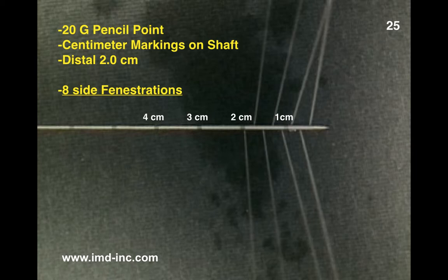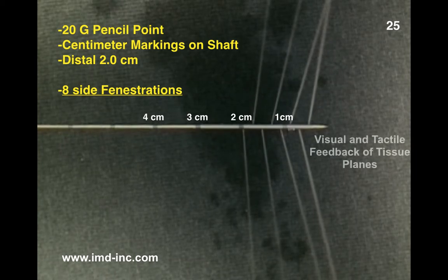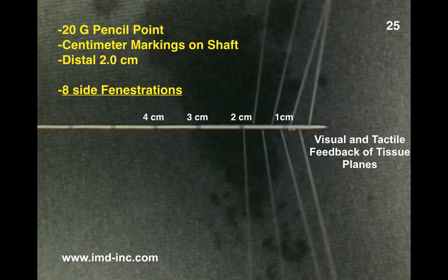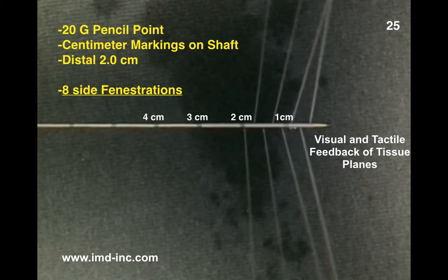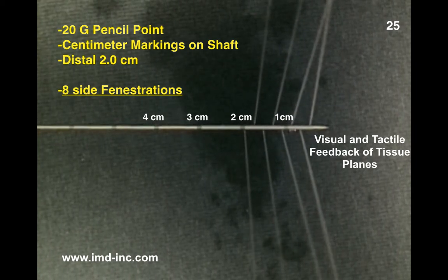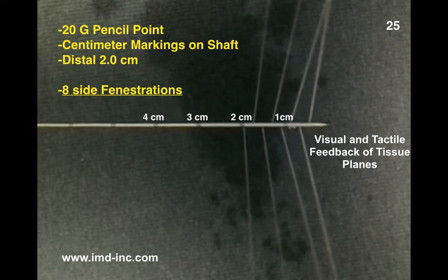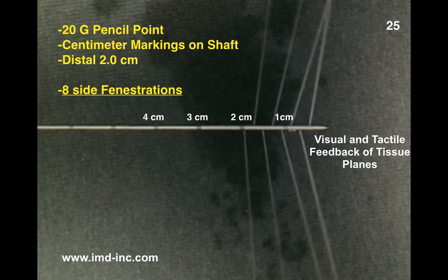It has a pencil point that provides visual and tactile feedback as it is advanced through tissue using ultrasound guidance. The distal 2 centimeters of the needle has side ports along alternating sides of the needle. The inflow pattern during injection is demonstrated in this video.